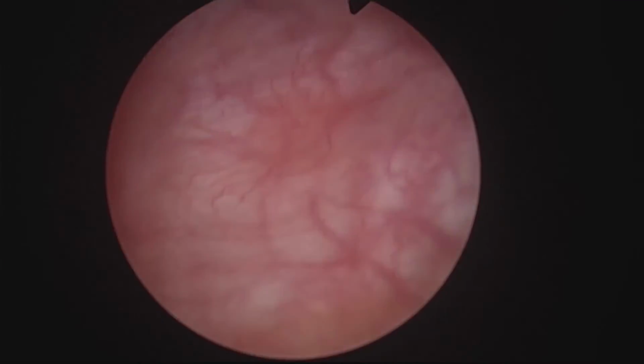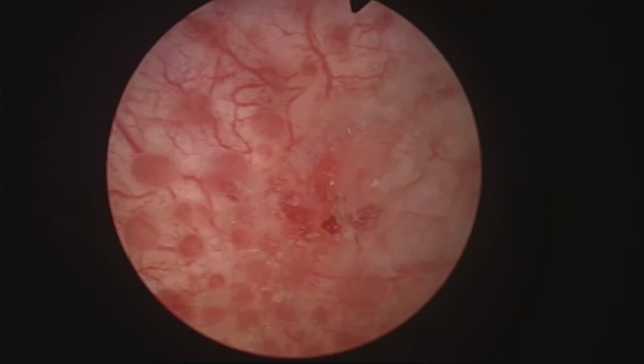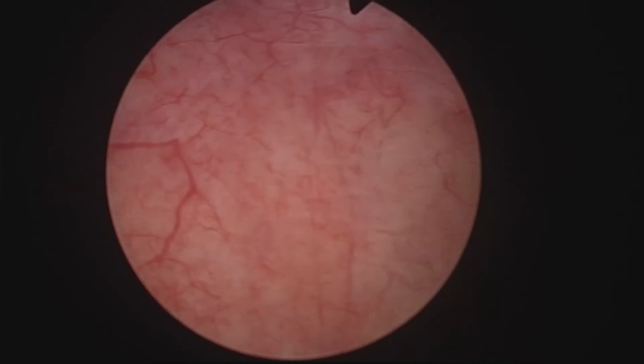Here you will see there's a little bit of bleeding, and that's because we decompressed the bladder completely. And of course, I didn't spend probably enough time to do perfect hemostasis. But I thought I'm going to come in with our resectoscope. So there you see there's some accumulation of blood. Here I think I was going to try to take the biopsy from the diverticulums. Just found the diverticulum. Look at these changes, you see. What is that?